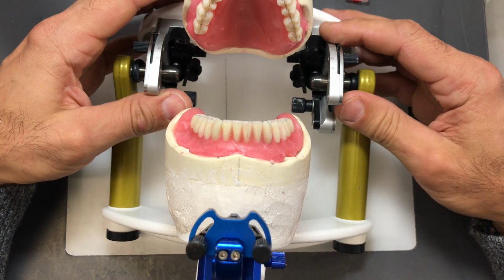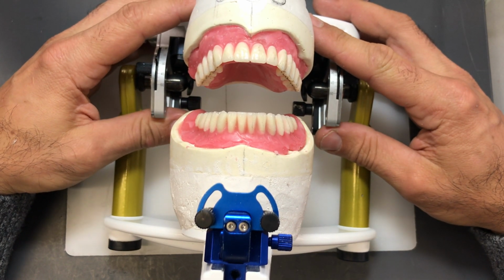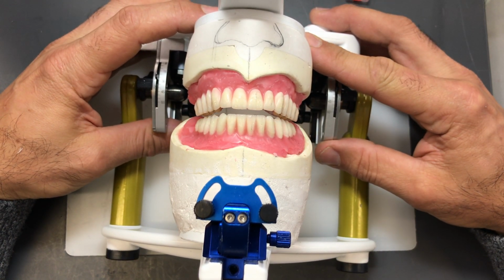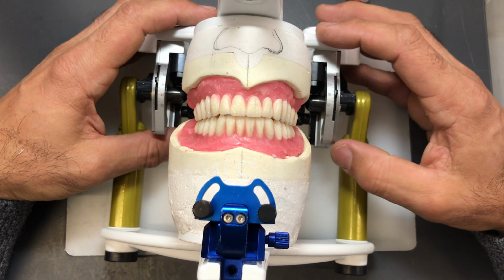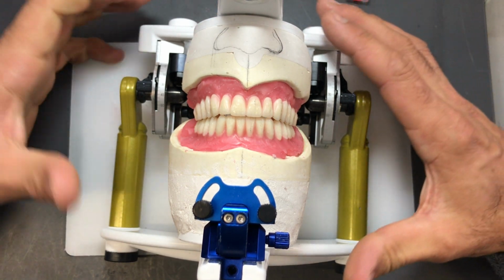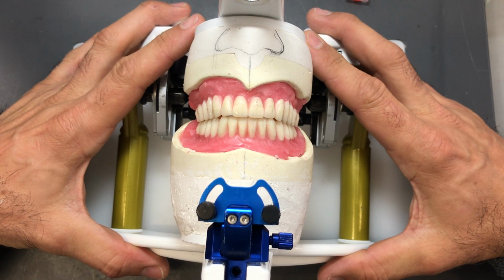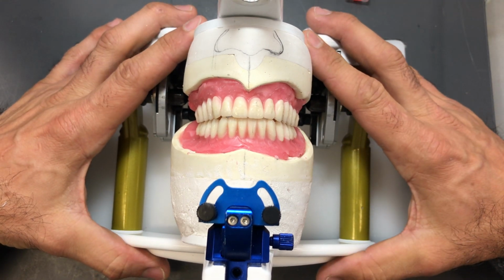When we bring the articulator together, we should observe a vertical overlap or an overbite. And we do, so we don't see spaces between upper and lower incisal edges. We should observe a horizontal overlap or an overjet, meaning the upper incisal edges are labial to the lower incisal edges.